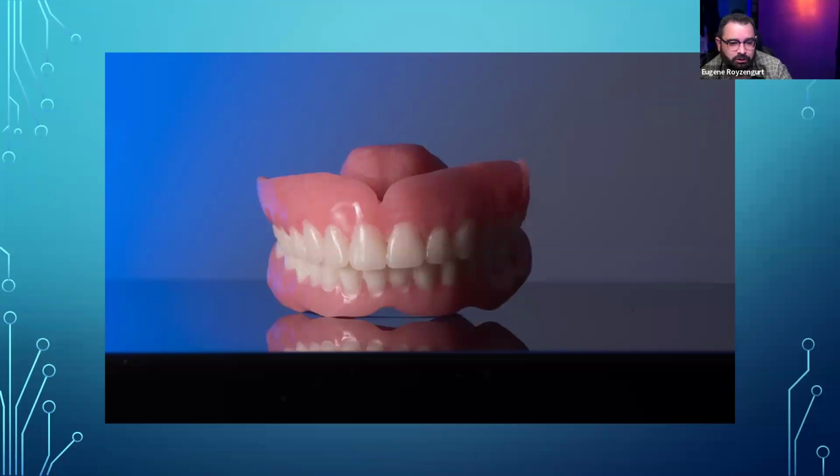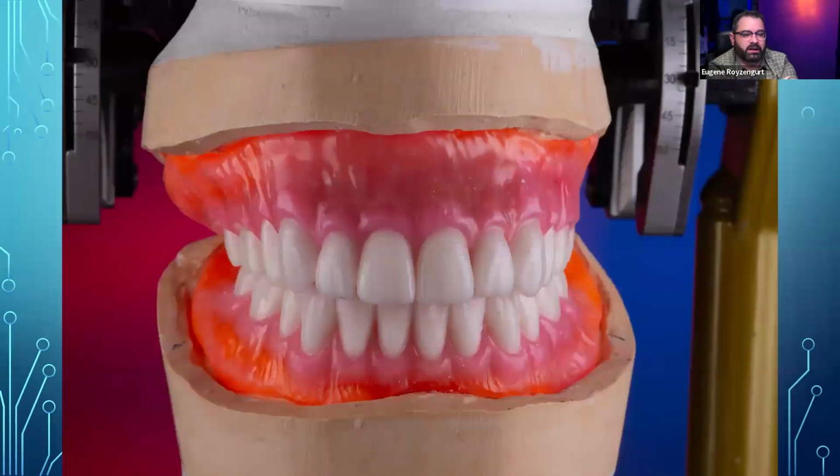Nowadays, what I generally will do, now for this particular patient, the doctor had the setup done. This letter messes me up quite a bit. But he said, I want to use that for the temporary, and we're going to use that for placement of the abutments because it's going to be a conus case. I said, no problem. So basically, the way you do these is a little bit different.